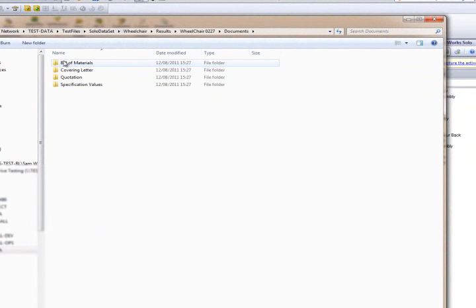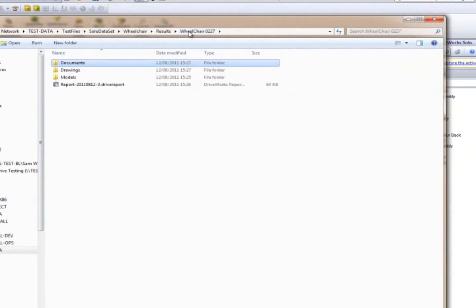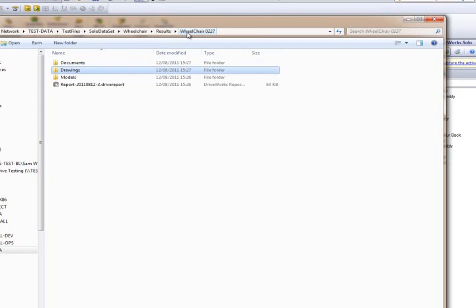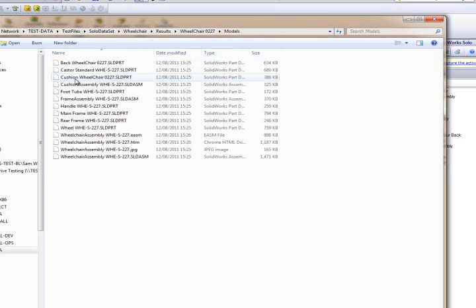Inside our documents folder, we have all our documents. Inside our drawings folder, we have our three drawings. And inside our models folder, we have our model set.